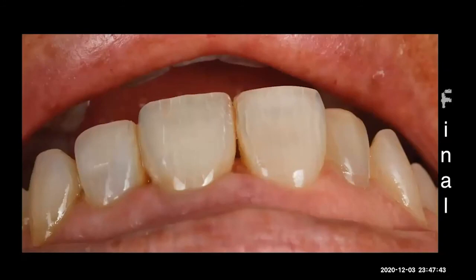Because it's an anterior case, everybody uses HT, because everybody assumes that HT means translucency and it's aesthetic. No, for me, it's the opposite. HT is a block that I use only for onlays because they need to absorb the concavity of the tooth. I use different materials for my aesthetic cases. I never use HT to make my anterior cases. I use LT, I use MT, I use multi. Multi is an amazing block, but it's a sensitive technique.